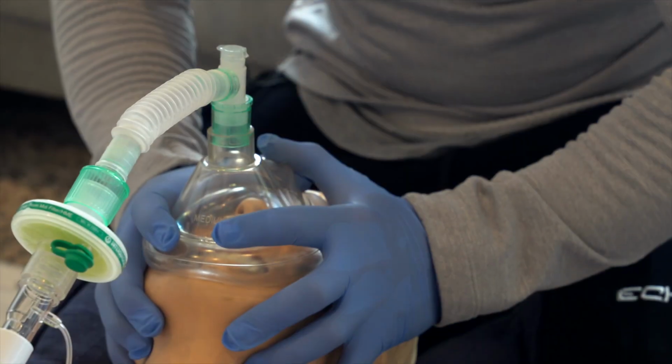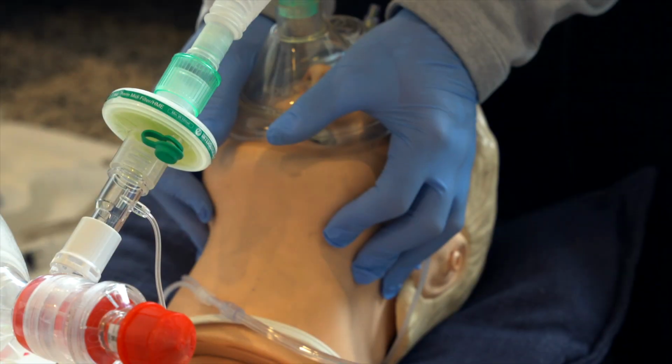Now that we understand the importance of pre-oxygenation, let's talk about how to actually perform it. After checking for dangers, applying PPE, and correctly positioning the patient, a bag valve mask should be applied. A good mask seal is vital, therefore a 2-person BVM technique using either the double EC or thenar eminence grip is recommended. The next step is to ensure that the oxygen flow is adequate to achieve an FiO2 of as close to 1 as possible.